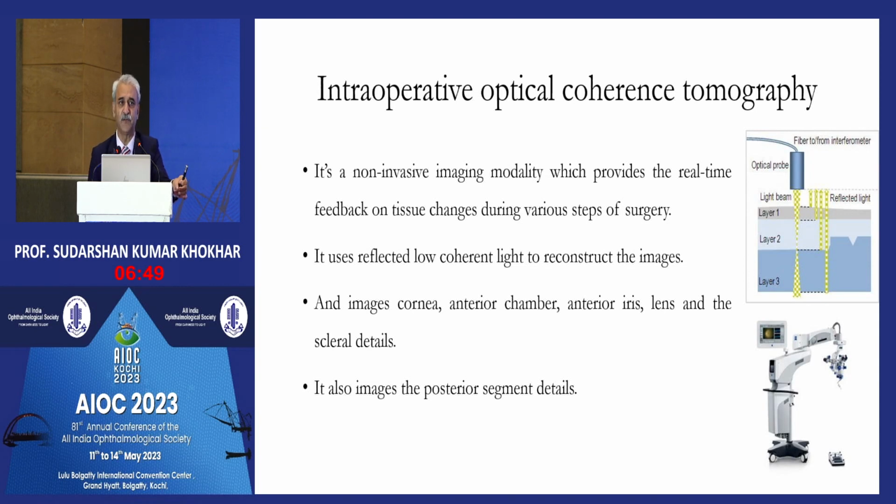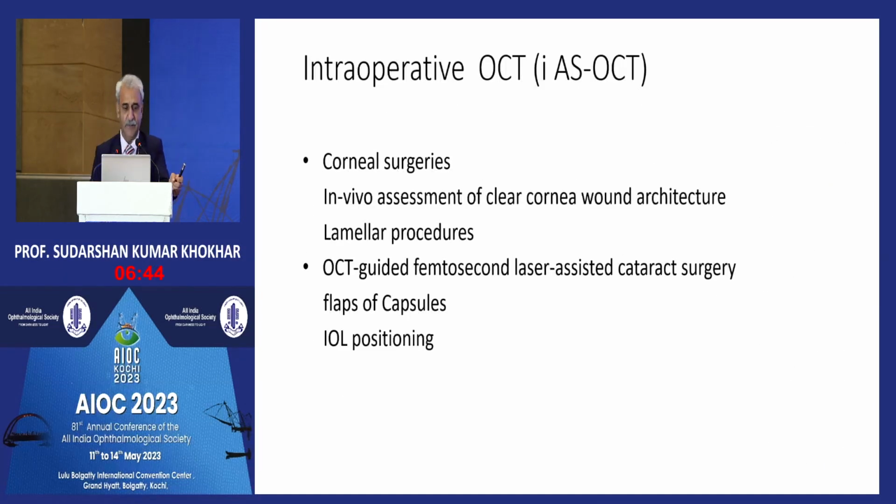and you can do the same thing intraoperatively during the surgery, going all the way from the anterior cornea all the way back to the retina. So in corneal surgeries, it helps you, especially the DSAEK, DALK, you can actually see the images. If you're doing a SMILE patient, in case the lenticule is not visible, put the patient on the OCT and you will be able to pick up the lamella very clearly.